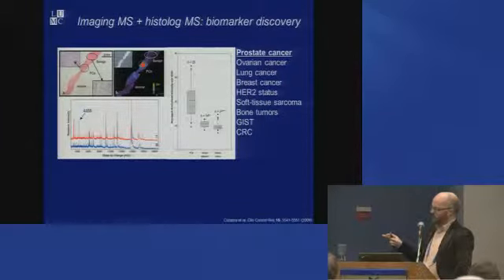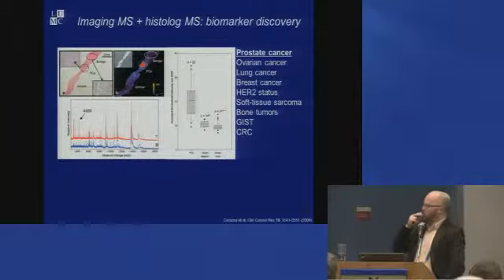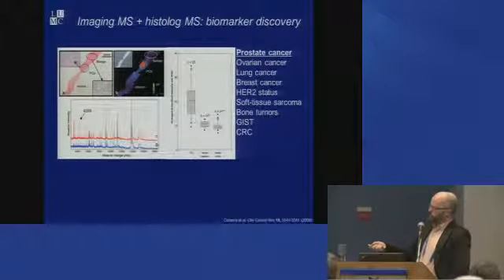this is actually a nice point to have a bit more of a discussion. Because this is the easiest type of experiment to do. You have a single tissue and you can select different regions on it. But the majority of the results have not really gone beyond these sort of candidate biomarkers.